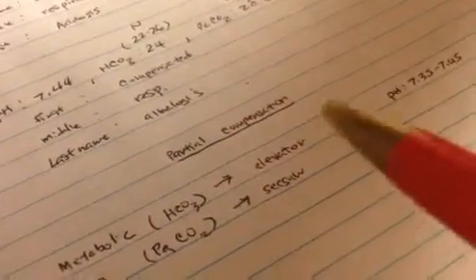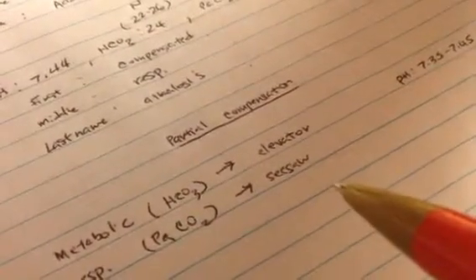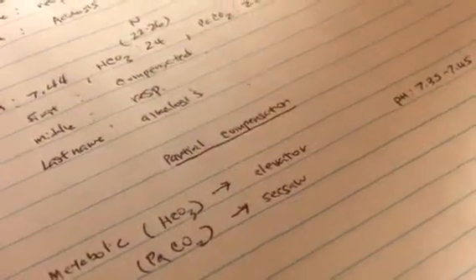Everyone, okay, so this is the second part of interpreting ABGs, and in this video I'm going to be focusing on partial compensation. In the last video I talked about knowing your ABG values and just basically doing a quick summary, saying how everybody has a first, middle, and a last name. So based on your values, you can assign them a first name, a middle name, and a last name to get the entire interpretation. If you want to know more about it, then feel free to go back to my last video.